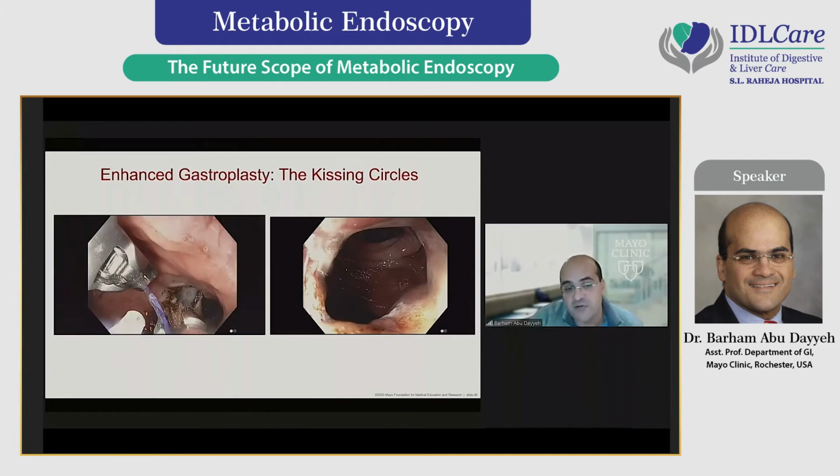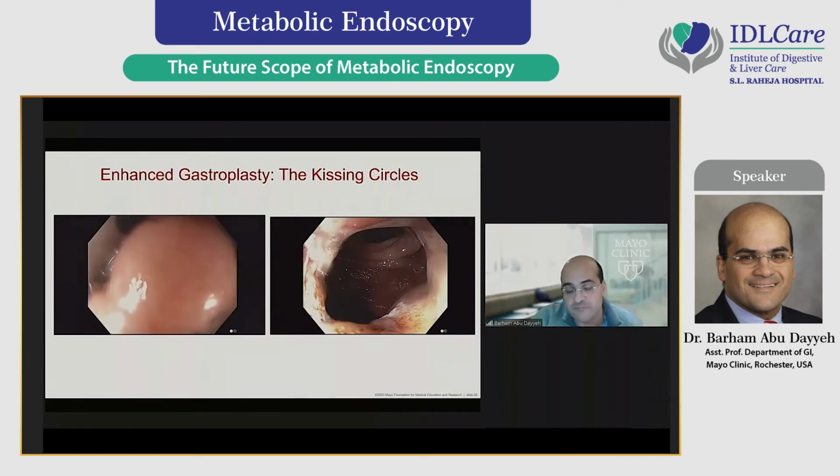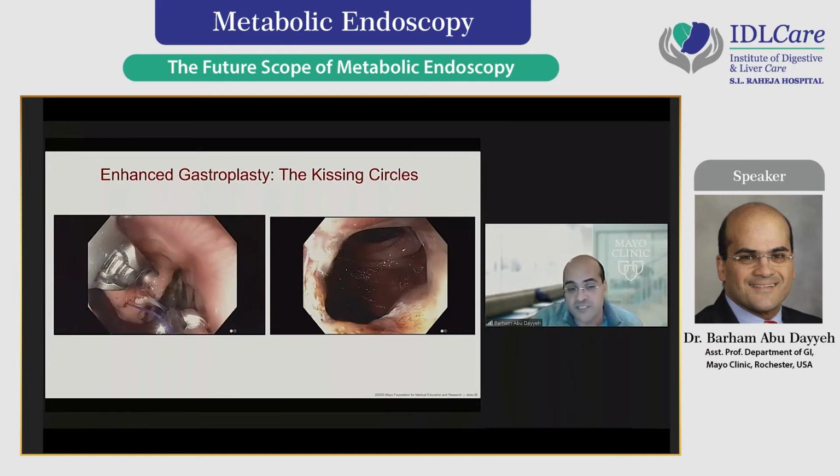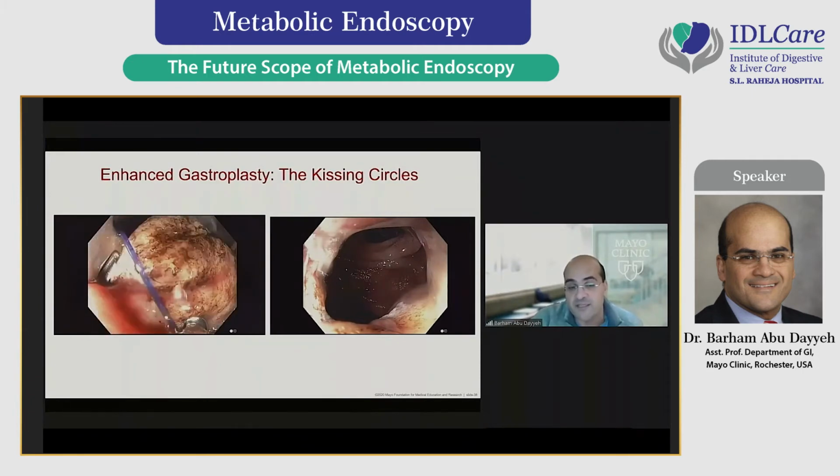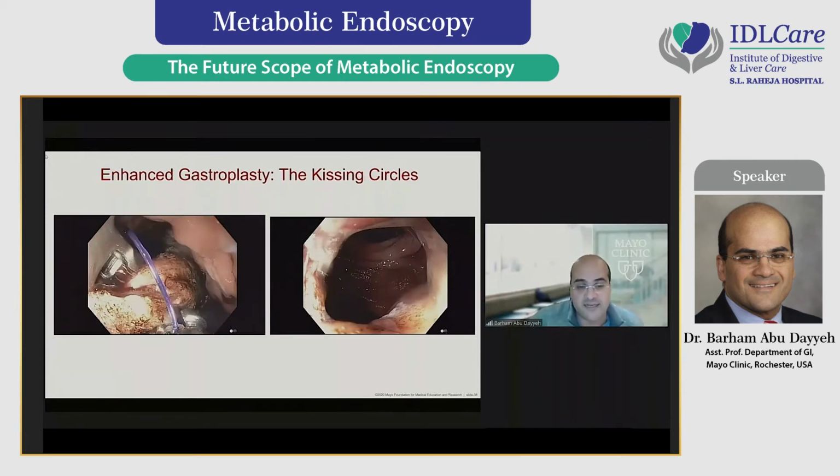So you could see here, we're using the Helix, and we're not going to suture inside of the EMR defects. That's dangerous. We suture to link these circles above. So the first bite happens above that area, and then we suture along the greater curvature, and then around the posterior wall, as we will see here. And now here we're going to the greater curvature. And again, the important part is we are not suturing inside of the mucosal defects. We're suturing in the untreated area in between these plications.